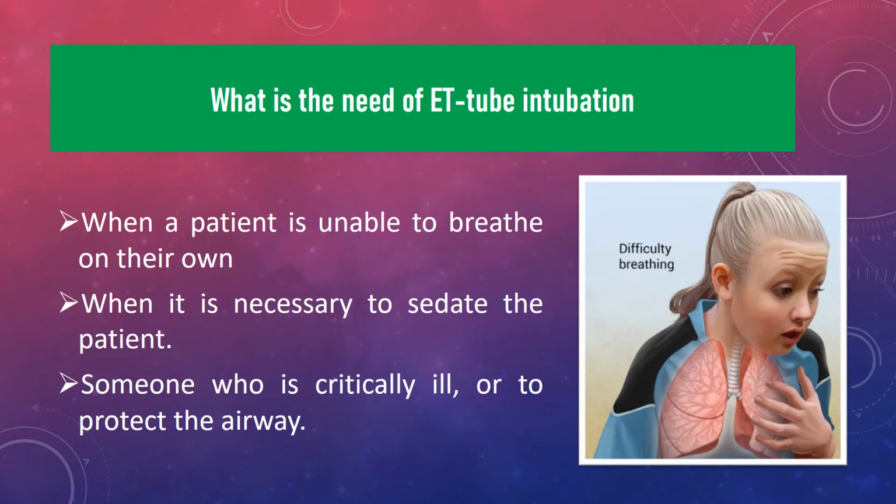Next is, what is the need of ET tube intubation? When the patient is unable to breathe on their own, if the patient has a chest trauma or any other condition, a severe allergic reaction, or asthma, or any disease related to the lungs, in those conditions we need to intubate the patient to provide mechanical ventilation.